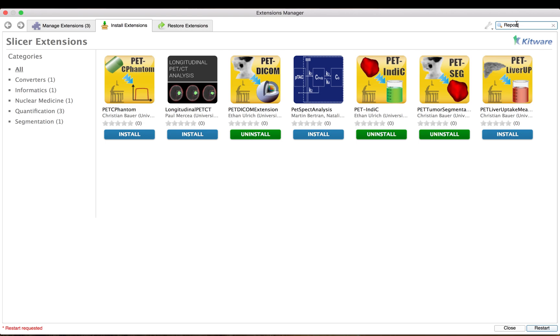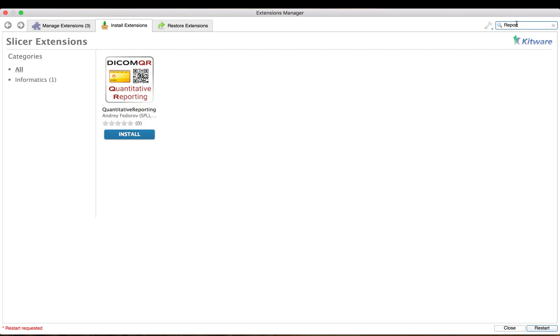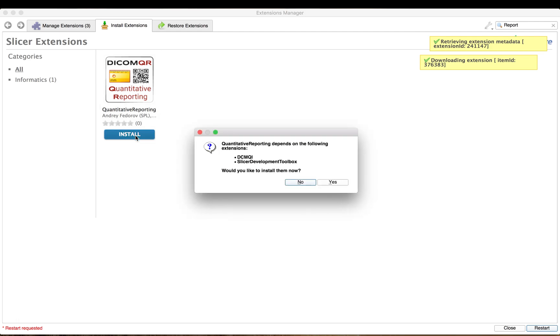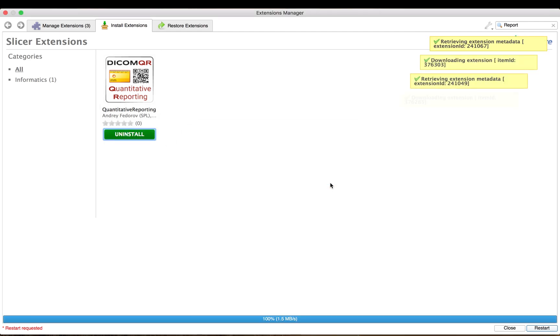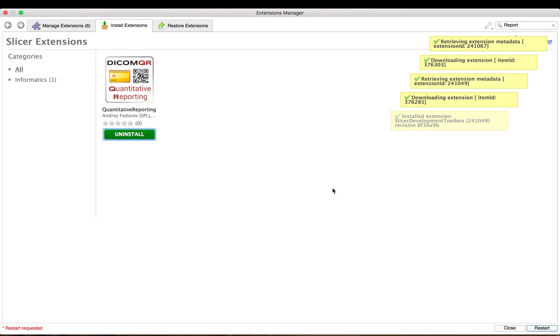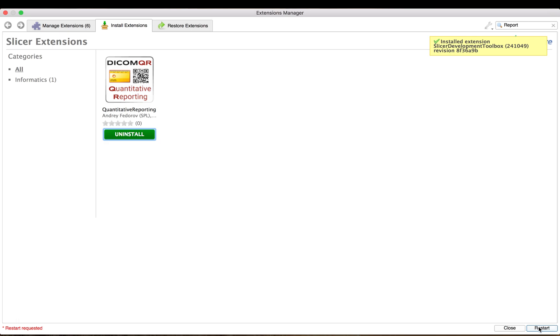In addition, we will install the DICOM Quantitative Reporting Extension, which supports procuring segmentations with derived measurements and allows export to DICOM SEG and SR files.